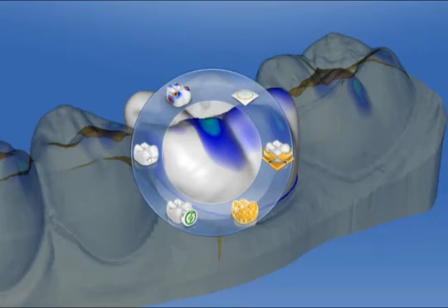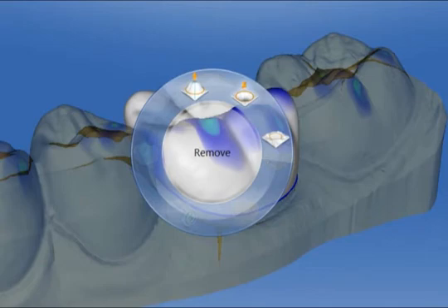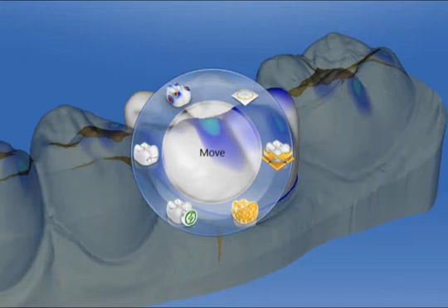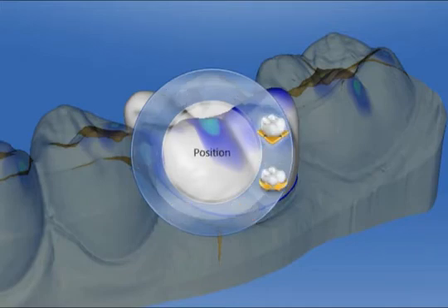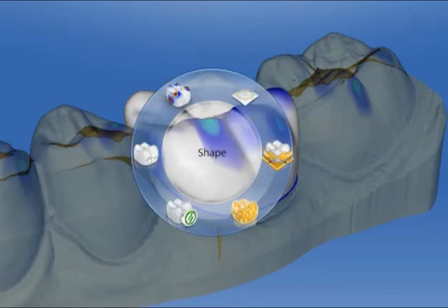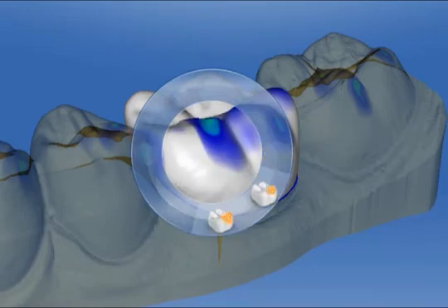On the top right is the Form tool, which removes, adds, and smooths material. Below this we have the Move tool to position and rotate. Below this is the Shape tool with circular and anatomical modification possibilities.